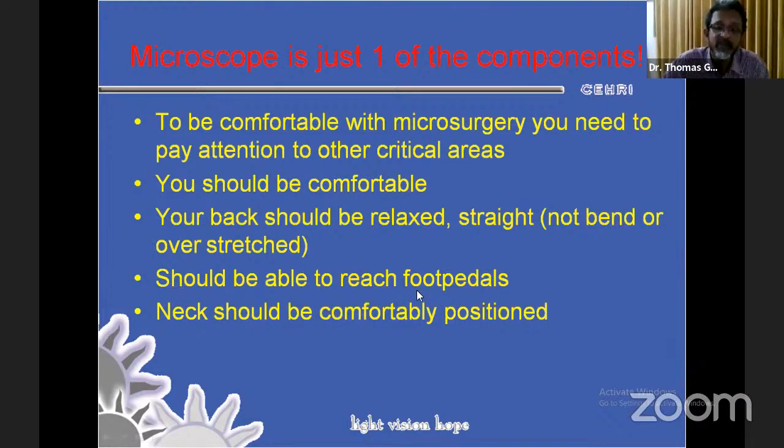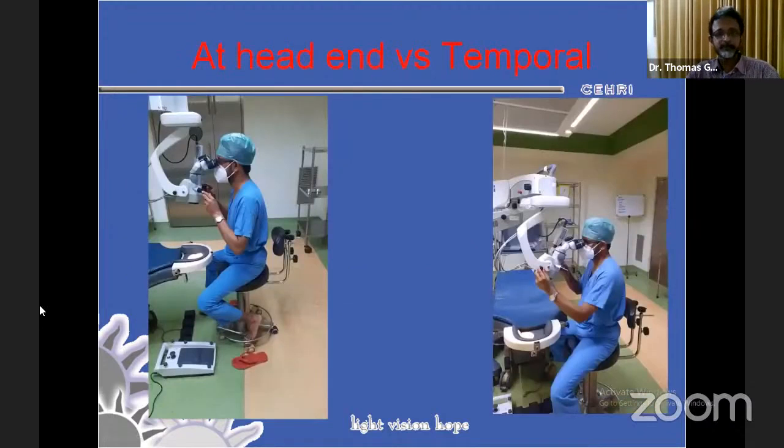You should be able to reach the foot pedals easily, and it shouldn't have to stretch. So if you're too tall, you push the foot pedal away from you. If your legs are not reaching it, you can even ask for a footstool to be under the foot pedals. Your neck should be comfortably positioned. I already told you should be looking straight ahead and not down or up.